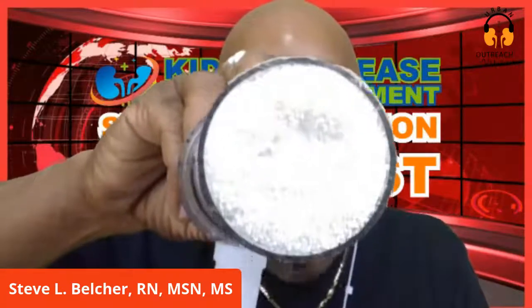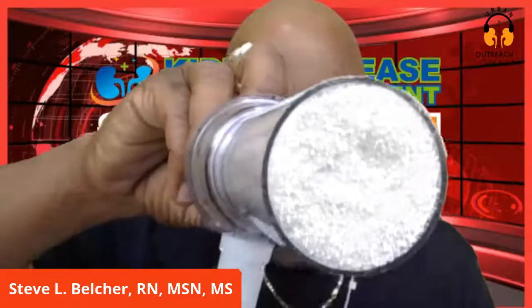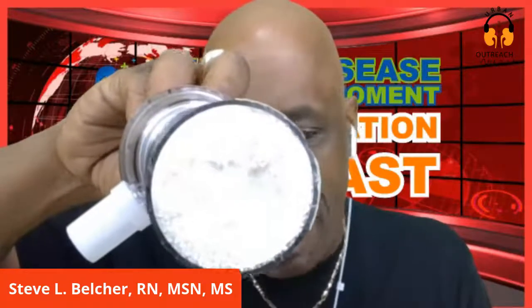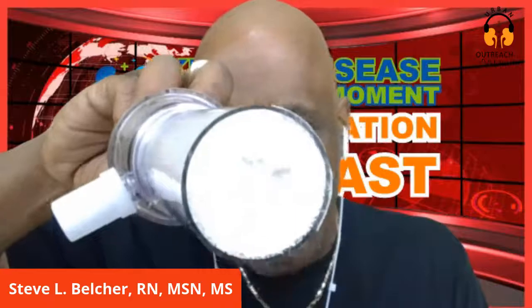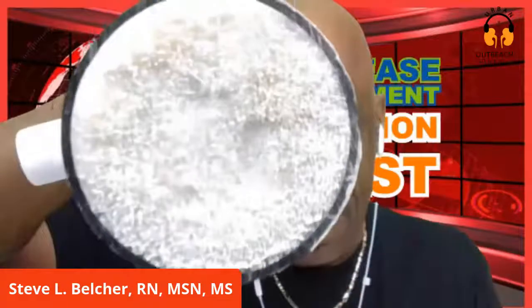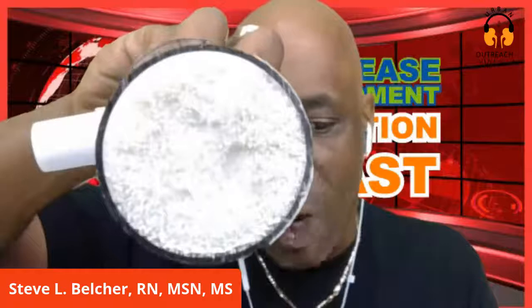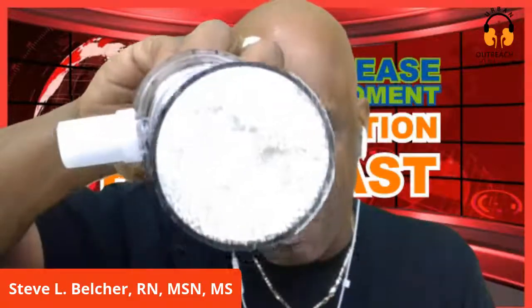The dialyzer filters waste from your blood. Only about two cups of blood leave your body at a time - that's about nine percent of your blood. There are two sections inside the dialyzer: one contains blood and the other contains the cleaning solution, dialysate. These two sections are separated by a filter called a membrane. This membrane has microscopic holes that water and waste can fit through, but blood cells cannot.